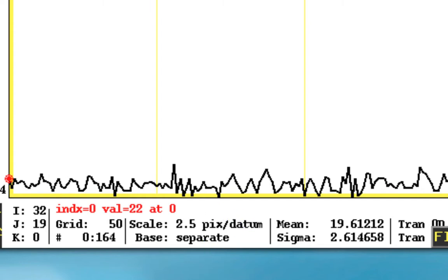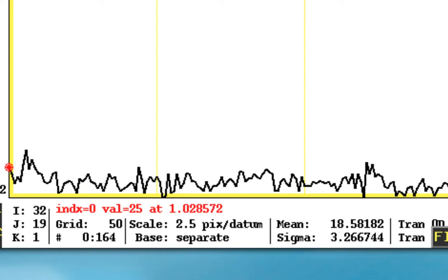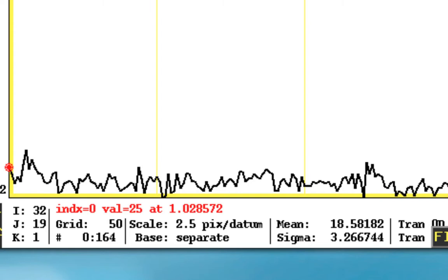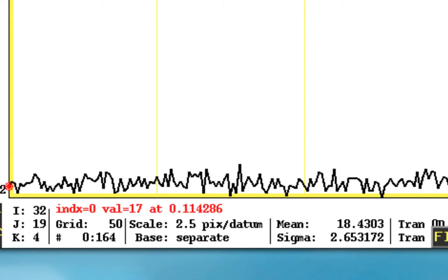Now because it's interleaved, we're going every other slice, and once we get to the top, we then go back and acquire all those other slices. So the next slice is actually just over one half of the TR, or repetition time. In this case, we have a TR of 2 seconds. So as we go up, you should see every other one increasing at a rate of about 0.057 seconds.